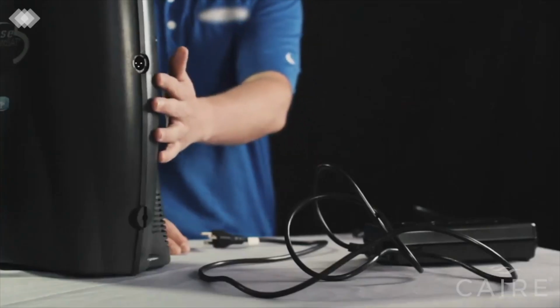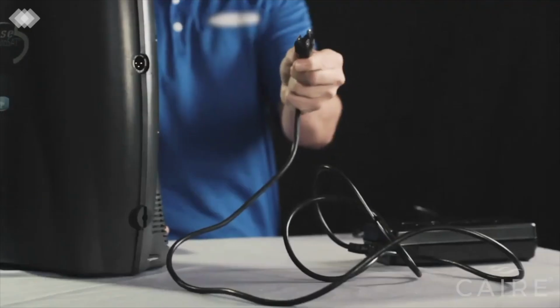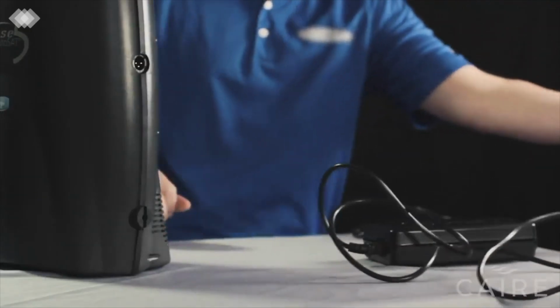The AC and DC power supplies are both installed into the side of the machine. When you're connected to external power, either the AC in your home or the DC in your car, you can both run the unit and recharge your battery cartridge. So for the AC power, you'll plug it into the wall. If this were the DC, you'd plug it into the accessory outlet of your vehicle.